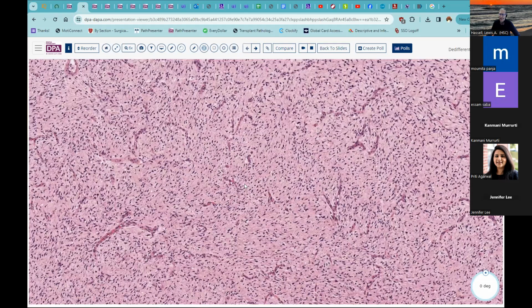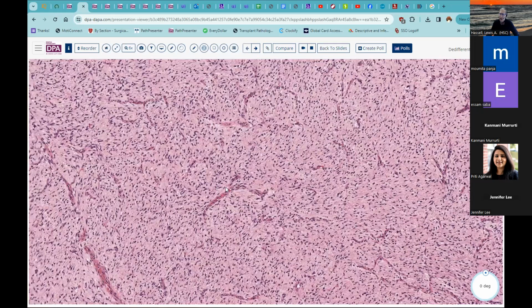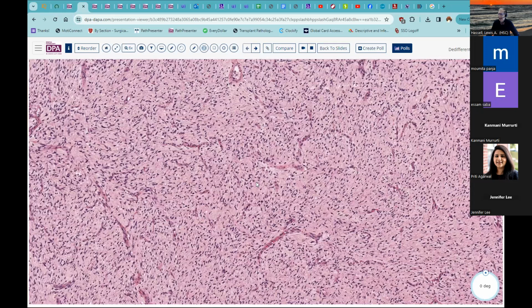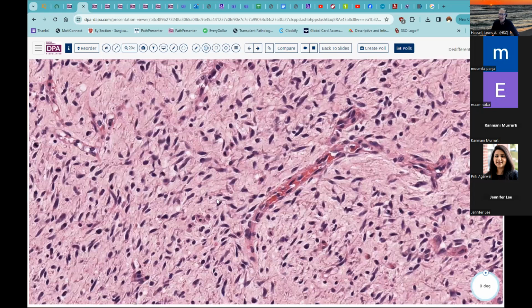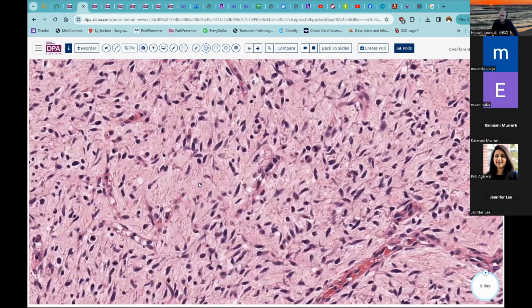tumor. Now, the interesting thing about dedifferentiated liposarcoma is that the dedifferentiation phase, the development of this solid pattern, can take the form of a low-grade or a very high-grade pleomorphic tumor. And so this is an example of really quite low-grade dedifferentiation in a well-differentiated liposarcoma. And as you can see here, we've got sort of arcing vessels and really quite a bland and low cellularity proliferation of spindle cells associated with this lesion.